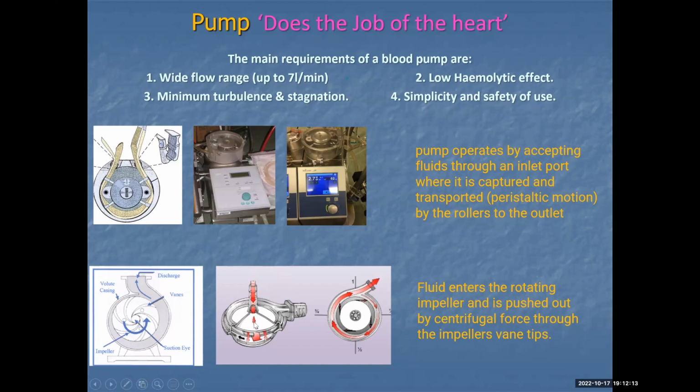So then we come to the centrifugal pump. The centrifugal pump is often considered for use when your bypass is going to be longer than 6 hours. In most cases, if you're talking about coronary bypass grafts or an aortic valve, you shouldn't be on bypass for anything longer than 2 hours.